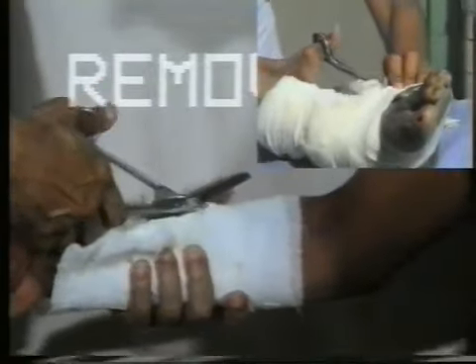Cut the bandage over normal skin and not over the wound site. Also, cut where the bandage is thinnest and not through the dressing materials. And now see how the bandage comes out as a single layer.